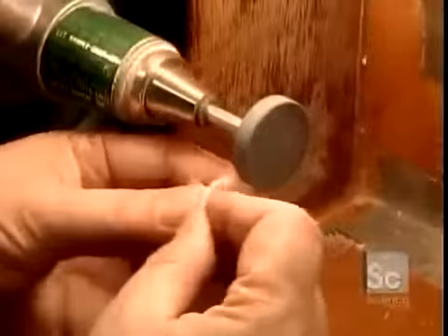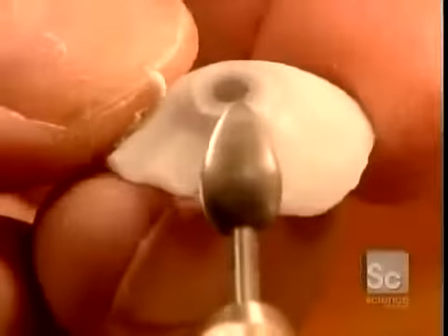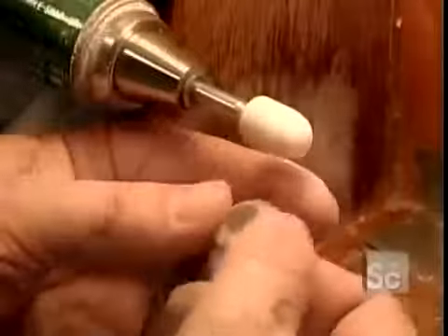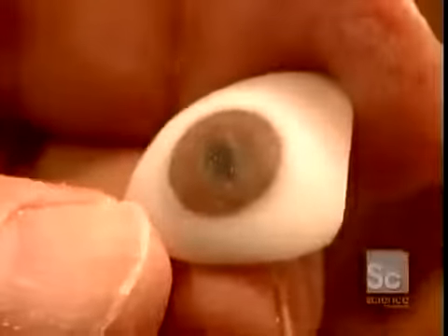They trim off that excess and the peg using a grinding tool and a cutter. This refines the shape and exposes the iris buried underneath. They smooth the surface against the grinding stem and verify the measurements.